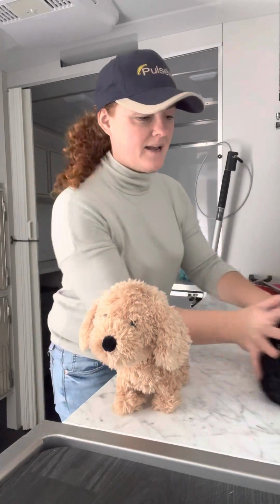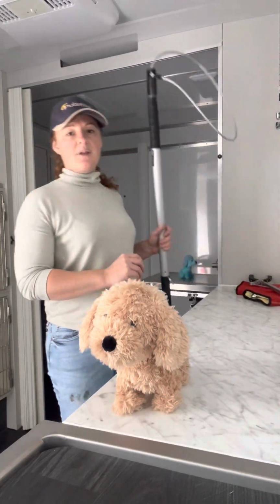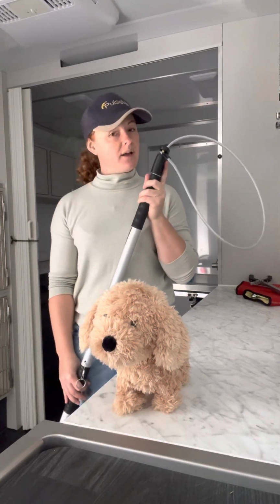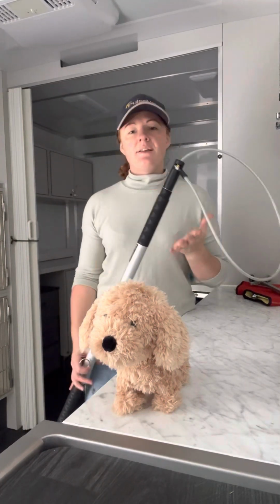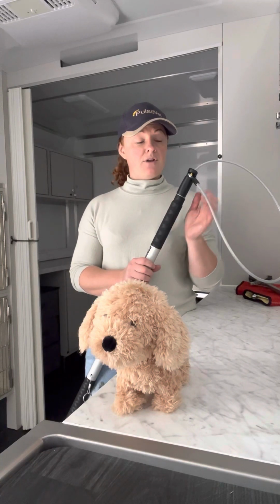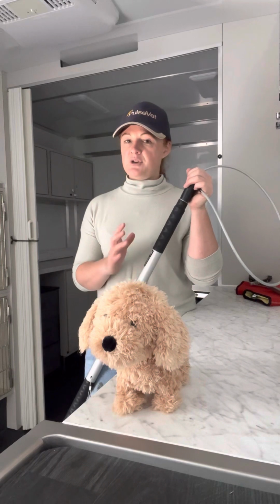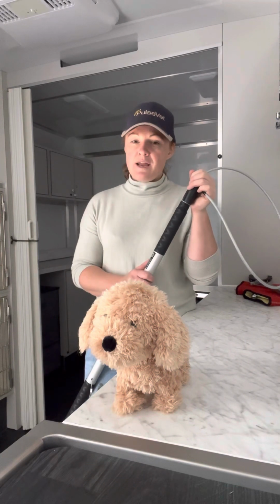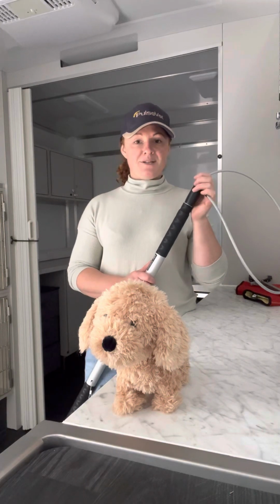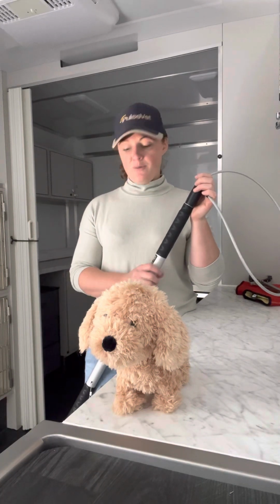And the final one is a catching pole. So the catching pole is a wonderful piece of equipment if you're dealing with dogs that you can't get close to. Perhaps they're stray. It's going to stress them if you try and touch them or pick them up. It's very good if you're working with dogs that you have a suspicion there might be an infectious disease, such as rabies especially. They can be very aggressive with that disease. You don't want to get bitten, but you do want to be able to treat the animal and help them.